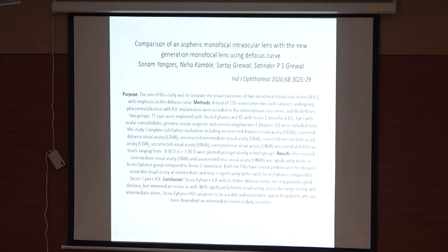And a study from our own city, also published in the Indian Journal, compared the defocus curve between the Technis monofocal and the Eyhance, and the Eyhance had a flatter defocus curve, and it not only provides distance but intermediate vision as well.